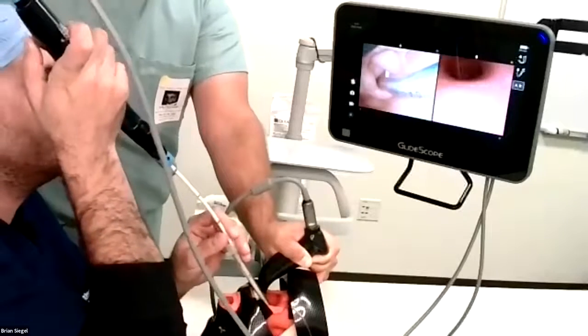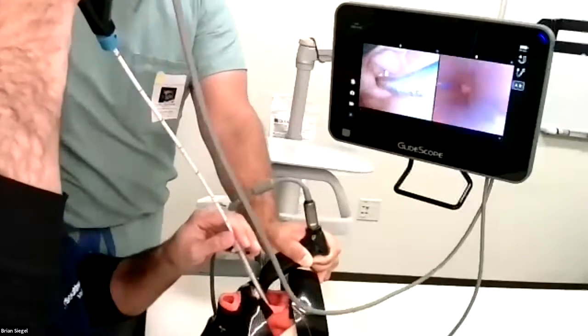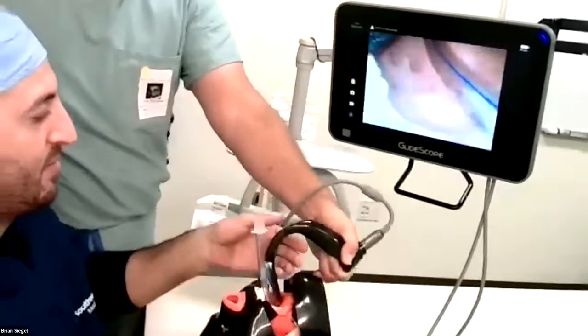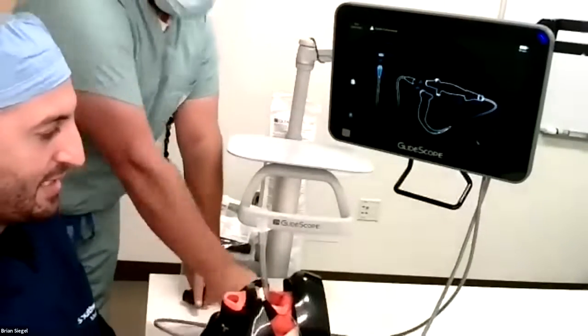And there you have it. So now at this point I would pull out my tube, we can disconnect here, and then we'll remove the blade. And it's that easy.